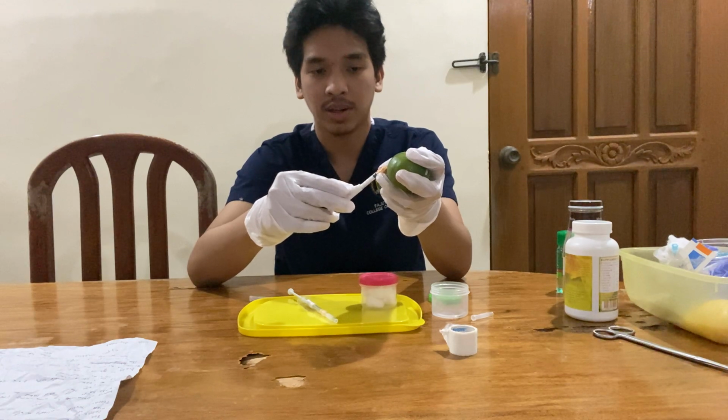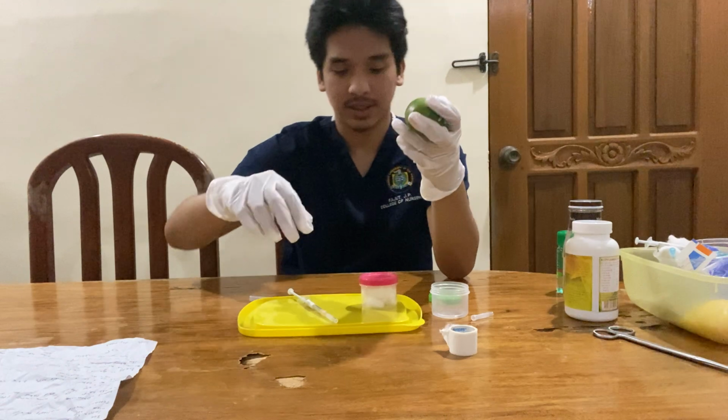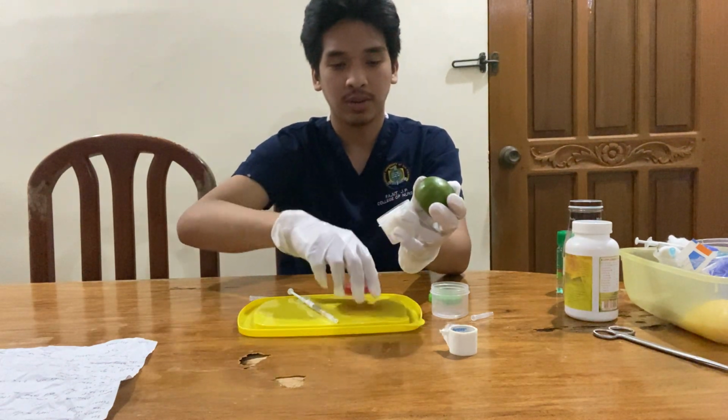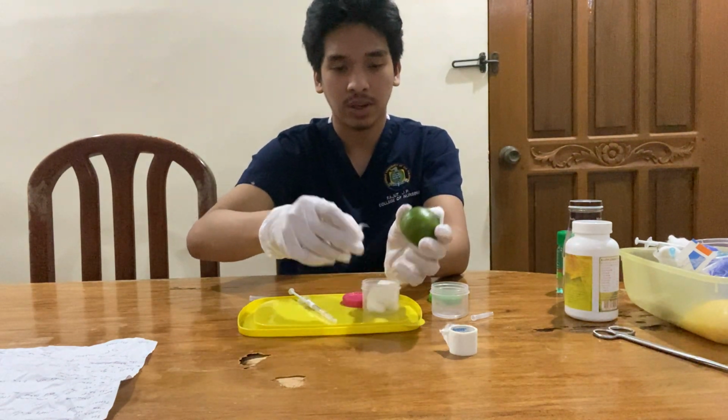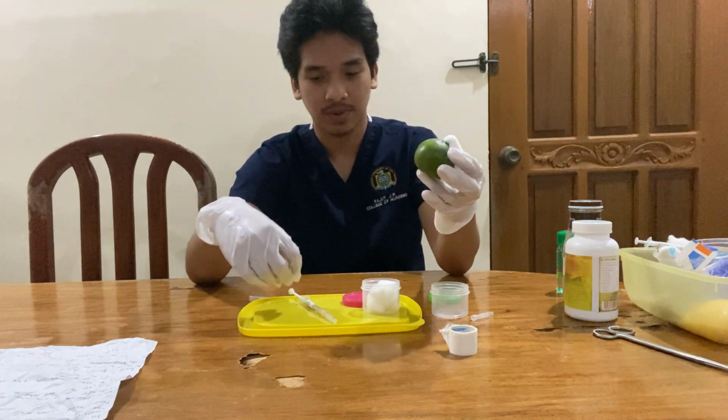Hold it with your non-dominant hand and then release. What we're gonna do here is we will only wipe it. Okay.